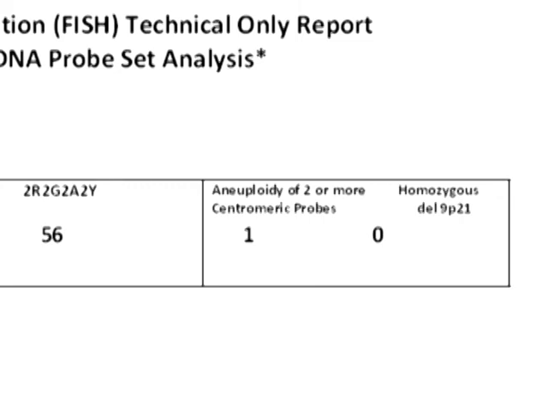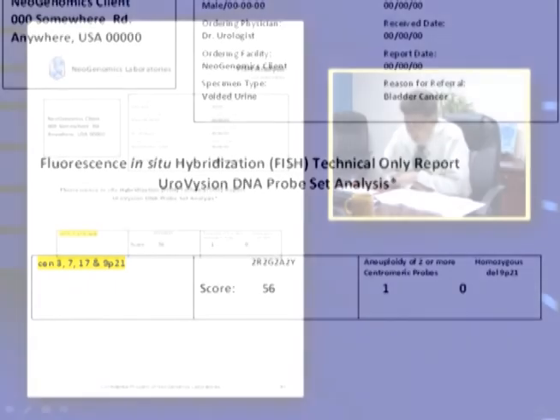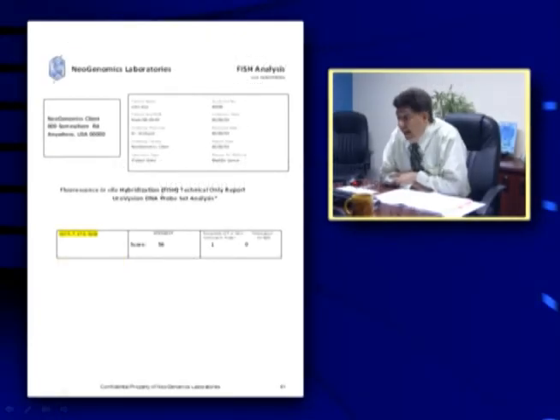So, based on what we just talked about, without even looking at the photographs that would accompany this, is this patient normal or abnormal? And why? Normal. How come? The average is below 4. That's right. Only 1 abnormal cell. And you know this is not a QNS because this is much more than 25 cells. There were actually 57 cells that were counted or scored.